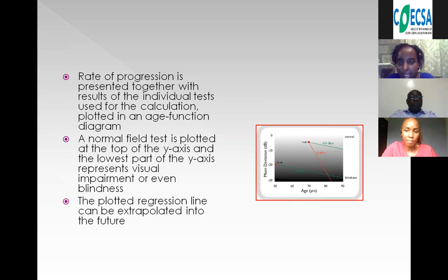There's also another patient, the one in red, who started at a high mean deviation but progressed very rapidly. The first progressor was progressing at -2 decibels. So they have declined and even gotten blind before the other 2, who are progressing at a rate of -0.2 decibels. So this is how the VFI can help, if one can see everyone.